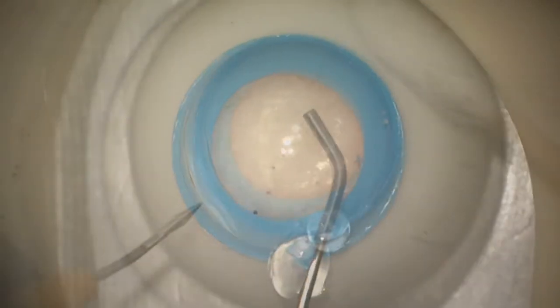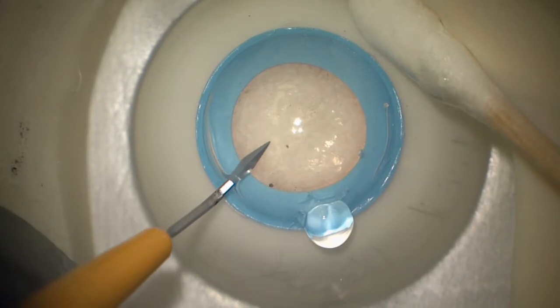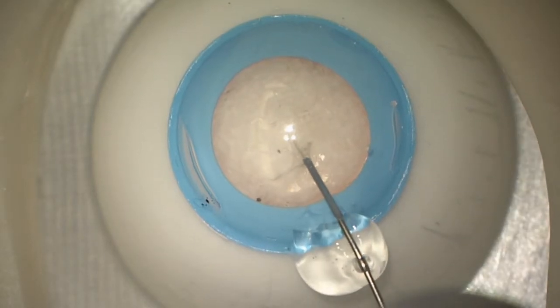One of the great things about these simulated eyes is that they're the same size as real human eyes, so you don't need extra-large instruments like you do when you're using pig eyes. The rhexis simulation is pretty good.